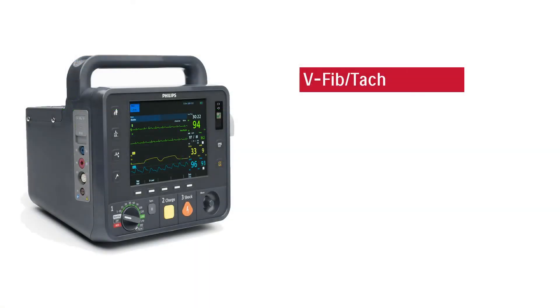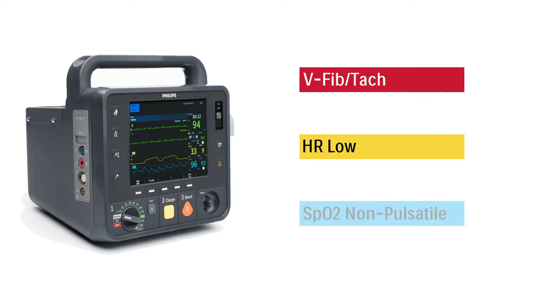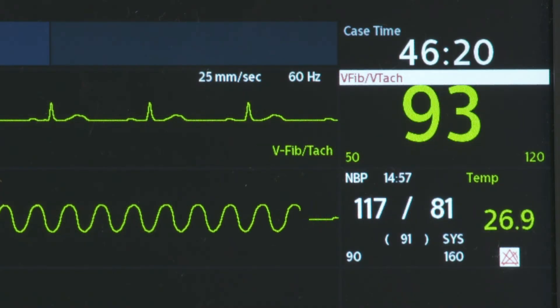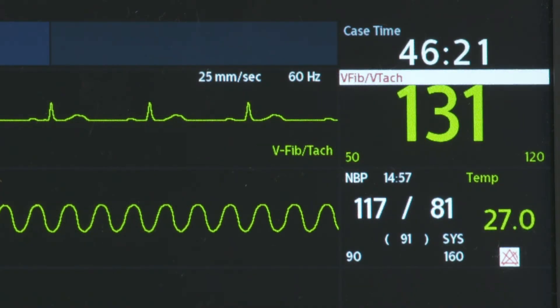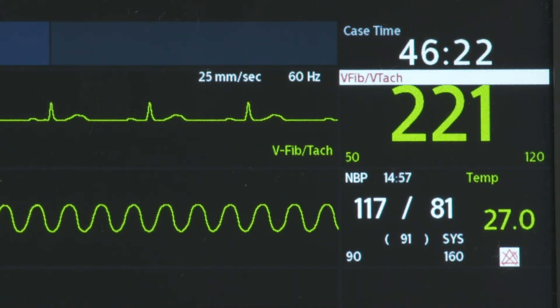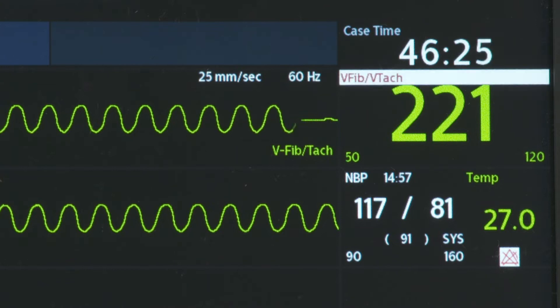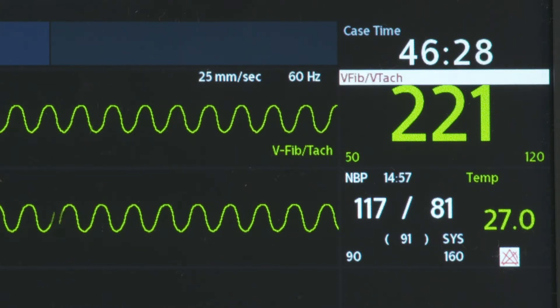There are three alarm types: high priority, medium priority, and low priority. A high priority alarm warns of a life-threatening condition, such as asystole or ventricular fibrillation, and requires an immediate response.